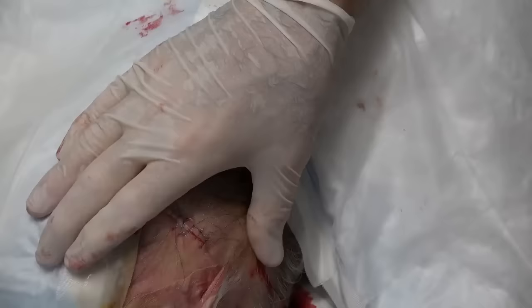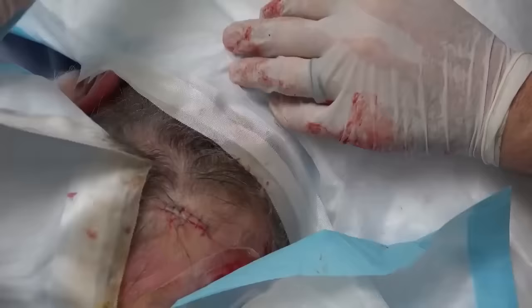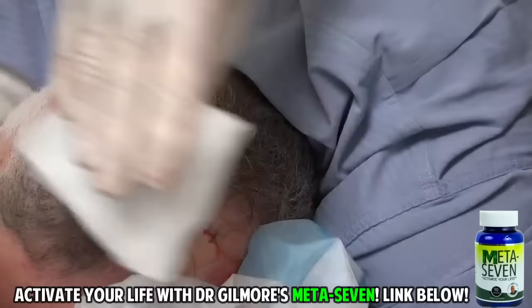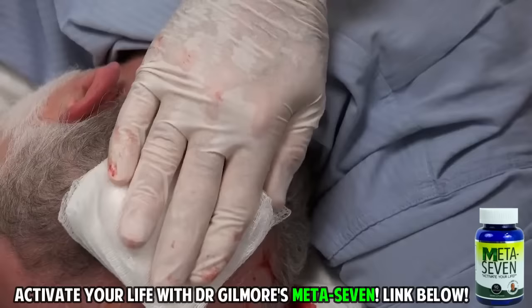Oh yeah, it did stick, didn't it? Does that hurt a little bit? A little bit. Let's do this one first — there we go. You got a four by four? Get this on over here. Sometimes that's the best way to do it. I had a little bit of blood there. Four by four.